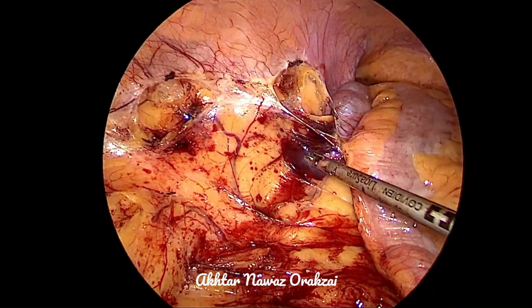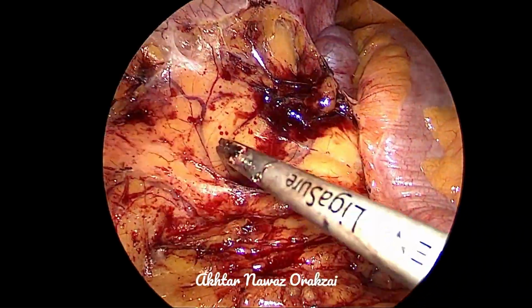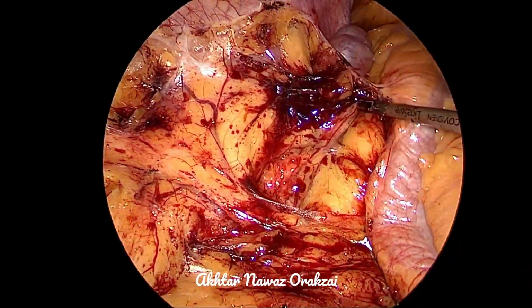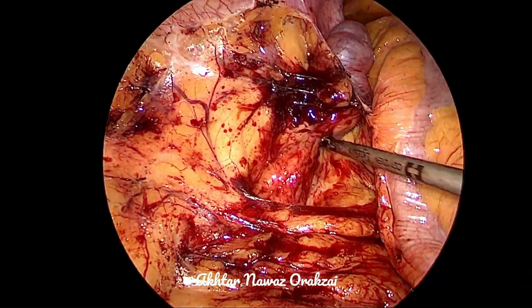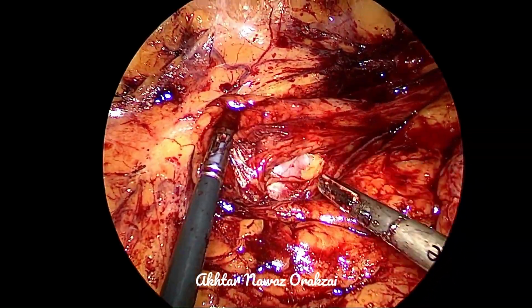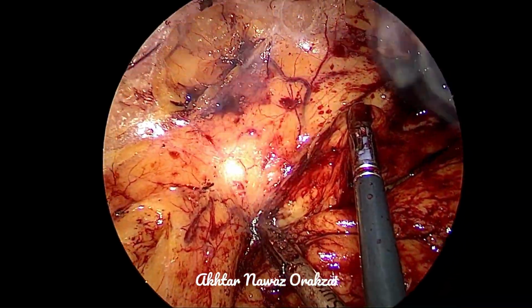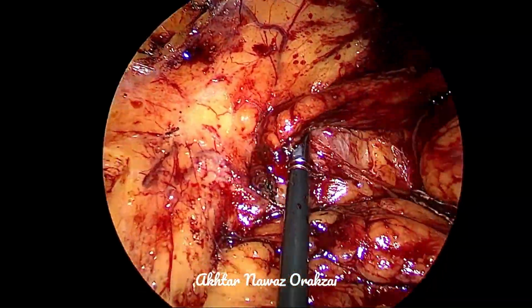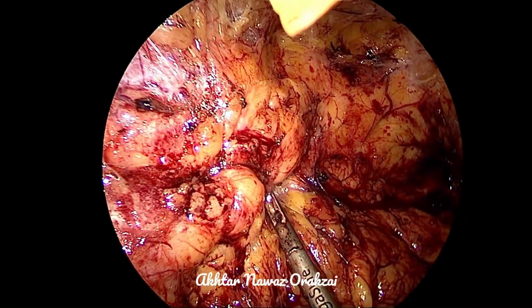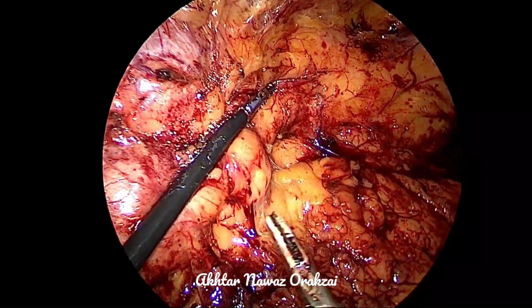Pyelonephritic means that the ureter will also be inflamed, and the structures around the ureter will be stuck to the ureter as well. So here care must be taken not to injure the bowel, not to injure any mesenteric vessels, and especially lower down, not to injure the common iliac artery. So identification of the ureter and the gonadal vein would be of utmost importance here.